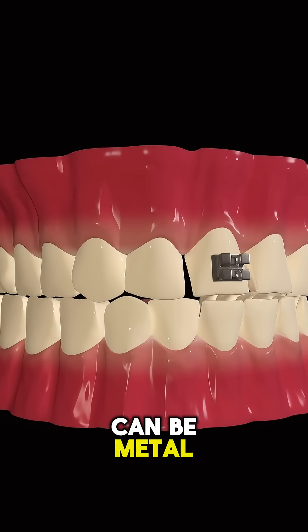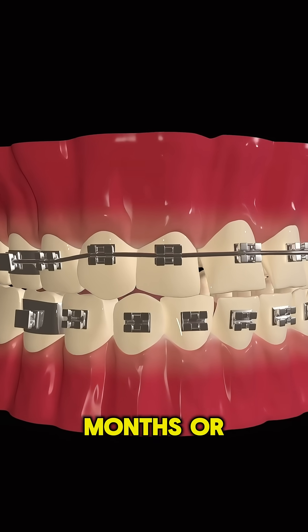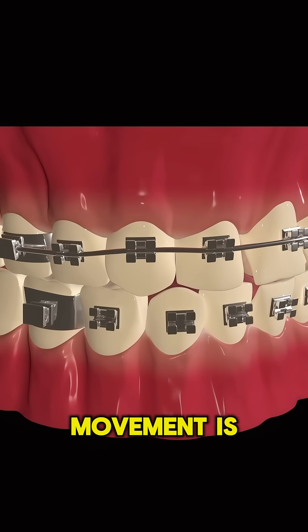Modern braces can be metal, ceramic, or even hidden behind the teeth. The process usually takes months or years, depending on how much movement is needed.